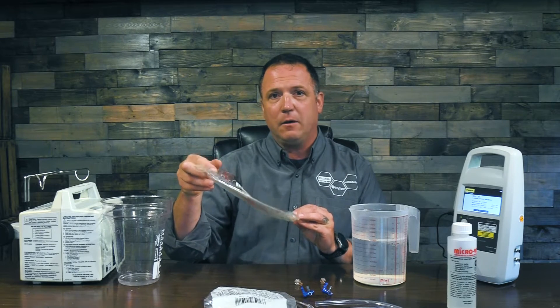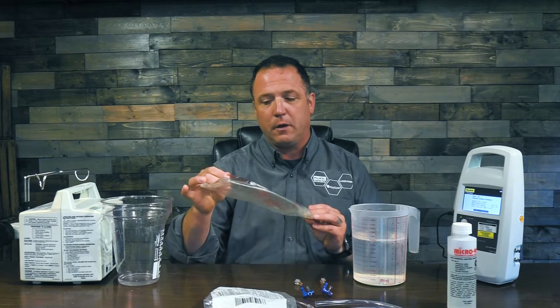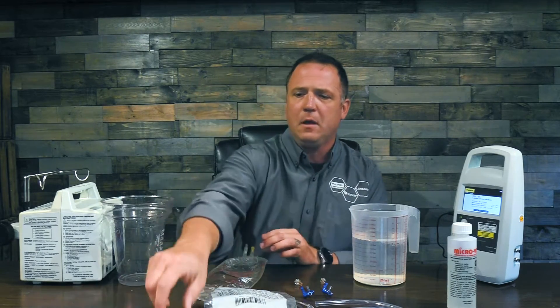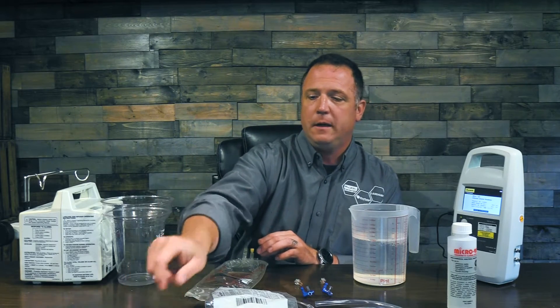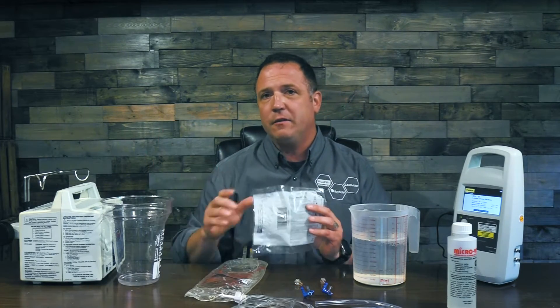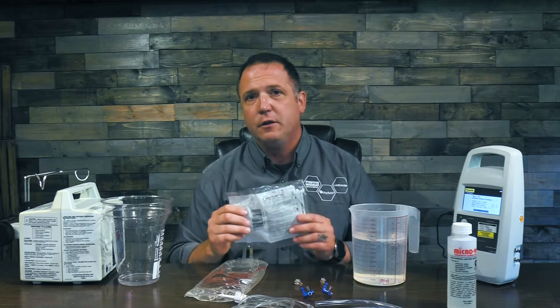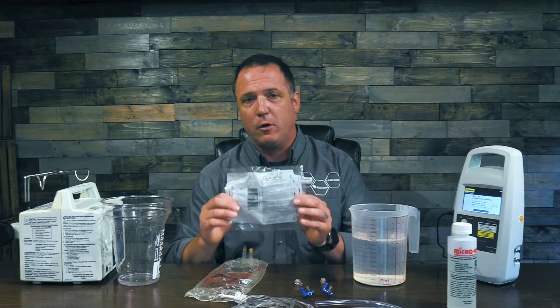I used an IV bag from the floor, drained it out, slid it open, and flushed it out really well with clean distilled water. I have a priming syringe and a syringe to measure my micro 90. Then I have my test set for my infusion pump — this is going to change depending on what infusion pump you have. You're going to need the right cassette or IV tubing for that pump, so grab your service manual and make sure you have the correct cassette.